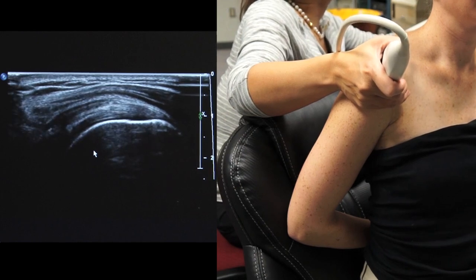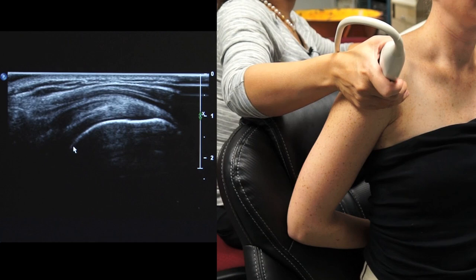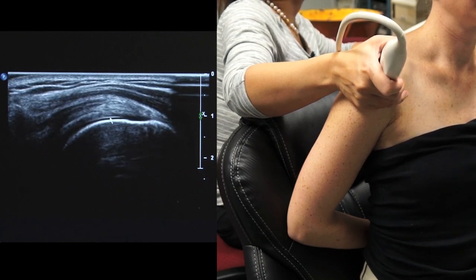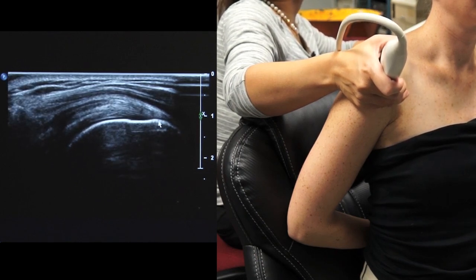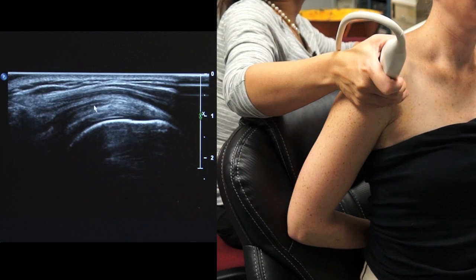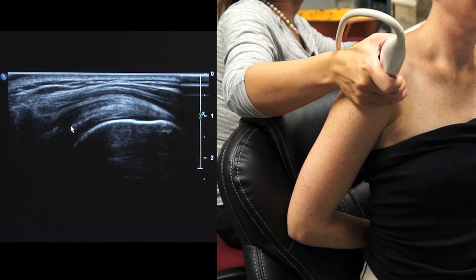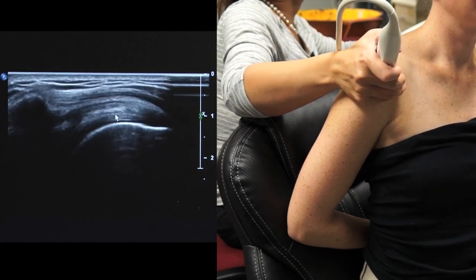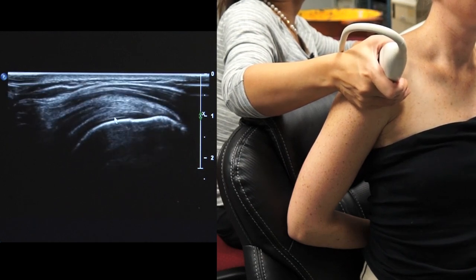If you want to, you can adjust the gain. You don't want to have too much gain. Okay, here we are looking at the humeral head. If you look closely here, you can see the hyaline cartilage. You see that the humeral head surface is smooth, the cortical surface. Here we are looking at the greater tuberosity. And here we are looking at the supraspinatus tendon as it is coming around and inserting on the greater tuberosity. Okay. Notice the parallel echogenic lines in the tendon.